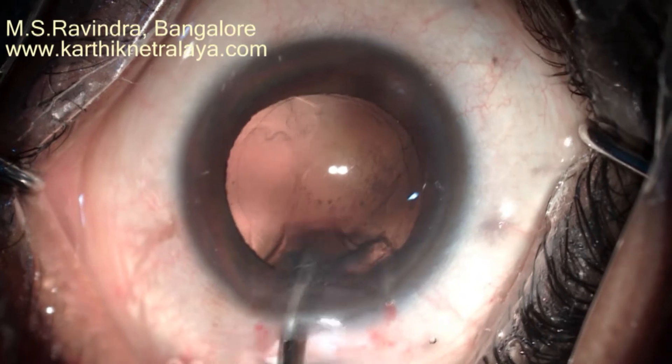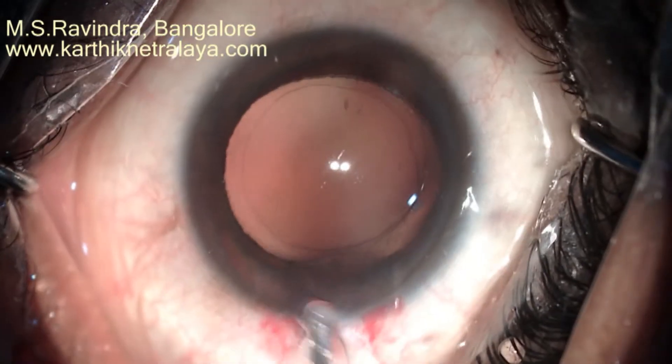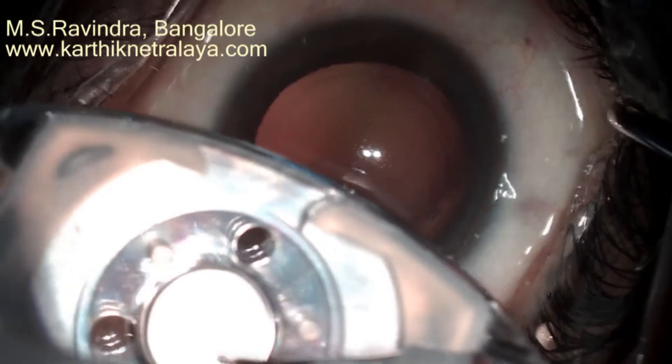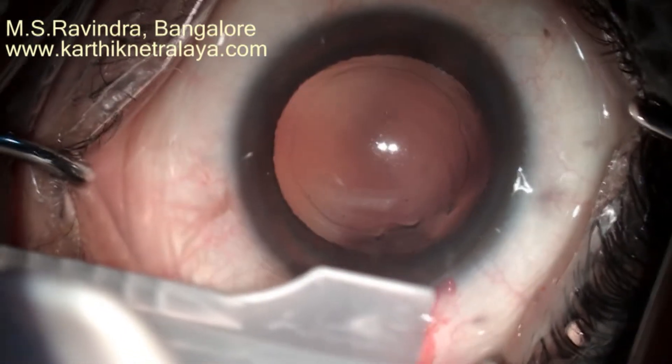There are no side ports; a single tunnel is used to perform the entire cataract surgery. The tunnel is not put under stretch at all. The AC is deepened, and the IOL is injected into a cartridge.